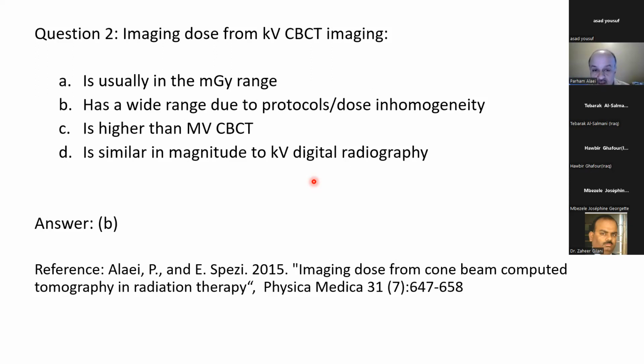It's a wide range. I think I had a slide that said less than 1 centigray to about 4 potentially, again, because there are different protocols, with different kVp and mAs units and different numbers of frames. And then the dose homogeneity matters, with different tissues.